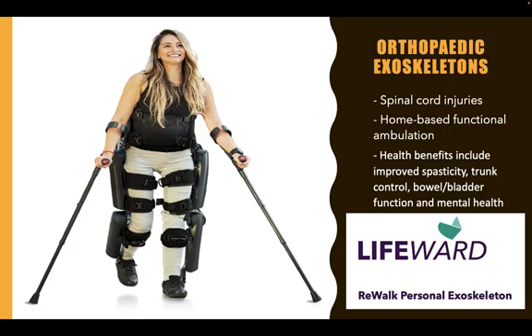Orthopedic wearables is an exciting avenue to venture into nowadays, because we can have both wearables, and I'm sure some of us are already wearing them right now. That could be due to the watches that we wear that are connected to our phones that measure the number of steps and our heart rate and other metrics like that. But for orthopedic wearables, they can have both internal and external options. You can have microchipped implants that can measure metrics, and you can be wearing electrodes on the outside to measure those too.